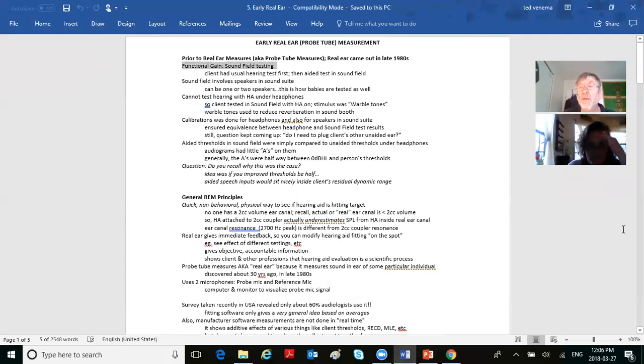Functional gain. Tina, did you have a question? Okay, so if you're using a current hearing aid that is open fit, it's going to be similar to the REUR. Correct. Yep, exactly. You've got it. All righty. Share screen.